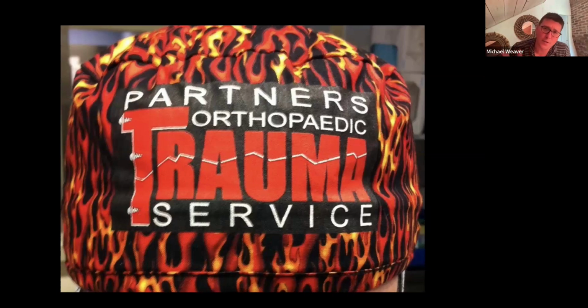The second thing is always template. Templating and preoperative planning go a long way in these complex cases. Certainly, I've learned a lot from my templates, and I've gone down rabbit holes that are not good, and you can identify that before you go into the OR, and I think that does your patients a good service. And then the last thing is I really think it's worth considering using these monoblock stems. They work out really nicely. So a revision monoblock stem is a great solution for a lot of these.